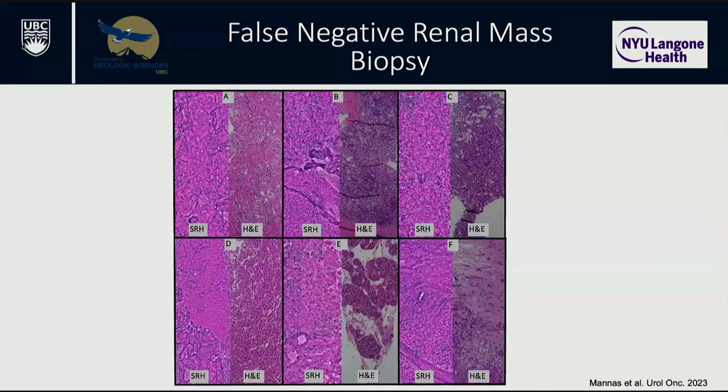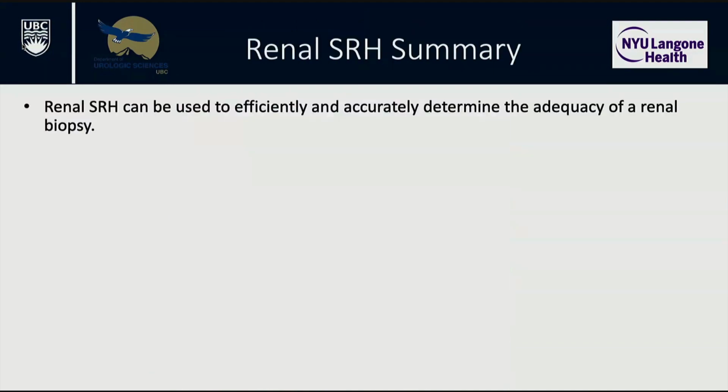So what we did is we looked at this, compared it from SRH to H&E. Now, one thing about H&E, and this is one thing I learned, obviously I spent a lot of time around the pathologist in the pathology lab. A lot of pathologic interpretation is actually looking at artifacts of what happens when you process it, clear cell. So you lost that cytoplasm, so it looks clear. So there are challenges between identifying subtypes, and this was just done in terms of describing the differences. And the classic things that you see for different subtypes are difficult to identify with SRH, but there are things that can be identified. Sometimes you get, let's say with clear cell, you might see changes in the capillary network, or the amount of cells and the arrangement of the cells around the network. So right now, I don't know if we can tell the difference in real time, but there does appear to be some differences.